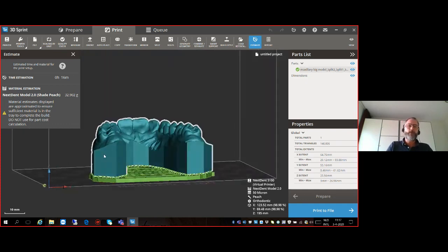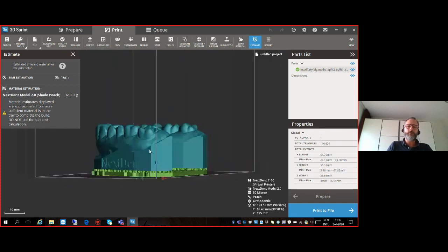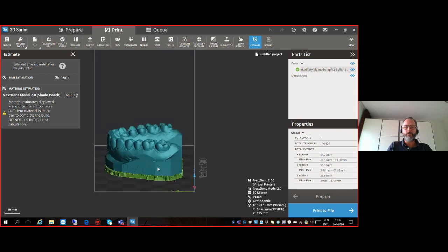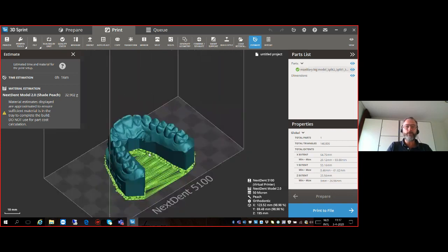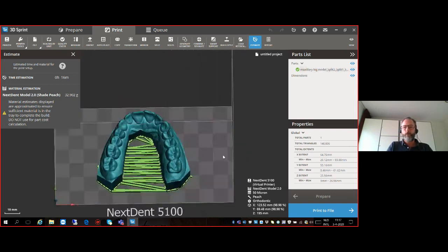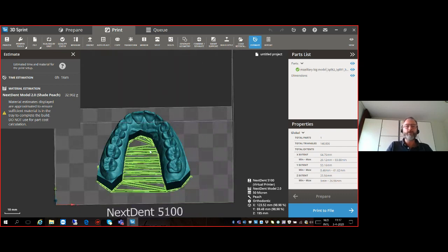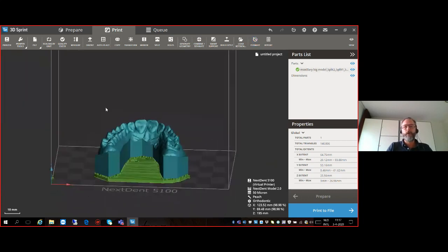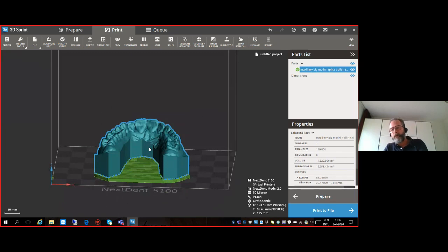For this particular model, if you fill the resin tray up to the minimum fill level — which equals 150 milliliters — you will have more than enough material. In fact, for all applications you can print on the Next Dent 5100, using the entire platform, the minimum fill level of the resin tray will be more than enough.